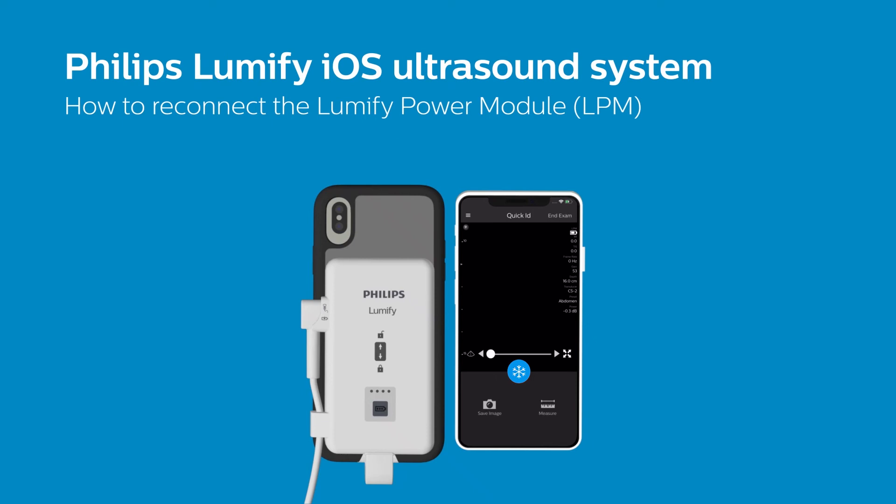If you want your LPM to remain connected past 10 minutes of inactivity, leave the Lumify app open and configure your iOS auto-lock display settings to Never. For more information on how to connect your Lumify iOS hardware, check out our other Lumify iOS tutorials.